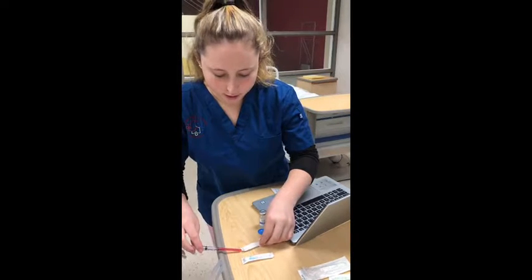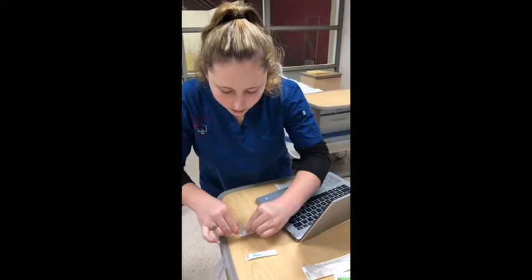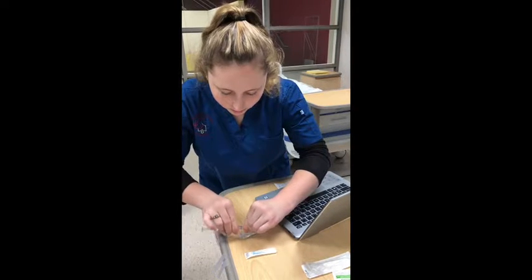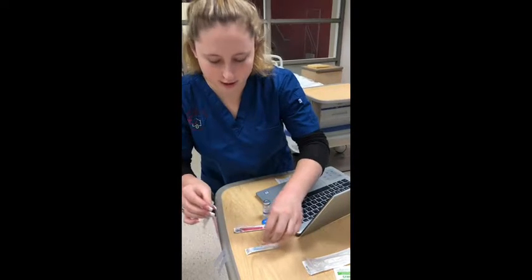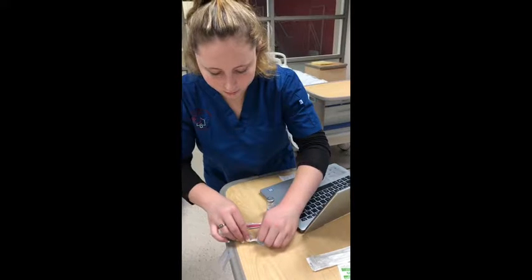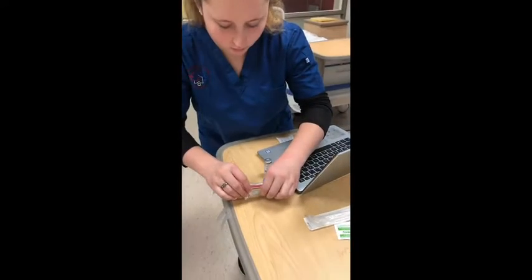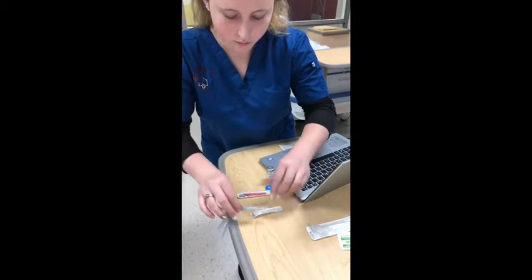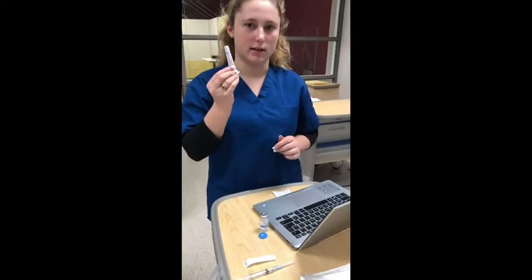And then I'm going to remove it, and I'm going to attach it to the 25 gauge needle. And then I'm going to dispose of this in the sharps bin.